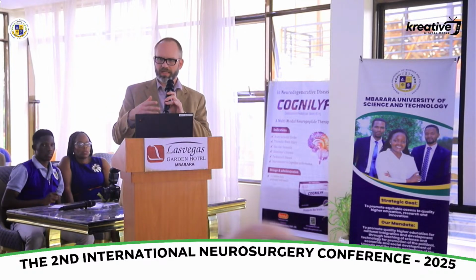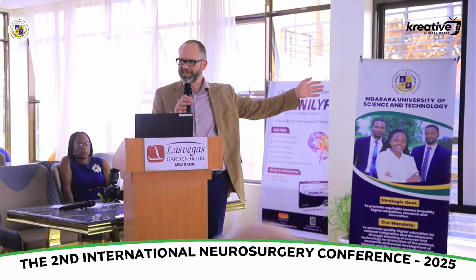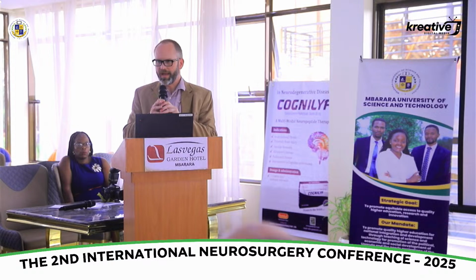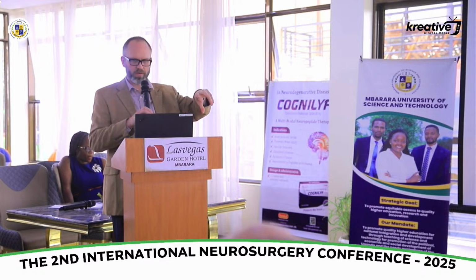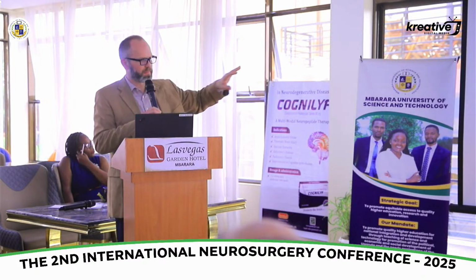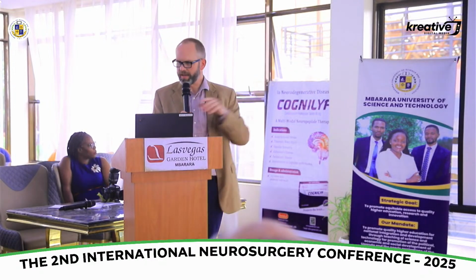Really, as soon as you start resection, well, ultrasound doesn't have that problem. After the craniotomy is done, I rely essentially only on ultrasound at that point.